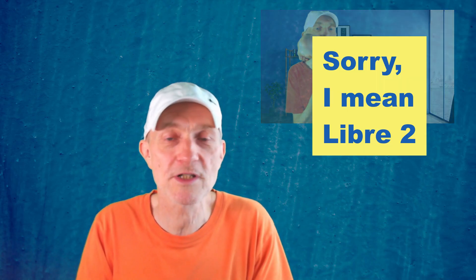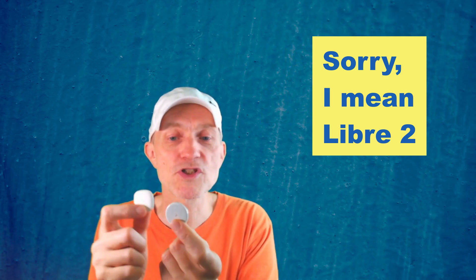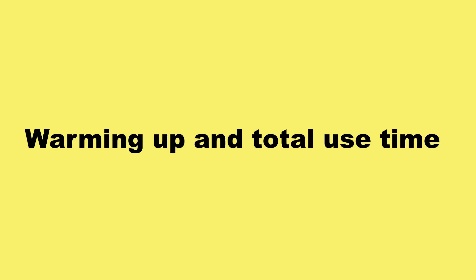Once it's on your arm, the sensor is similar in size to the Libre 3 — I hold them here for comparison. The shape is a little bit different; actually it's quite a nice shape, like a rounded rectangle. The warm-up time of the Simplera is two hours, which is longer than some of the other sensors on the market.